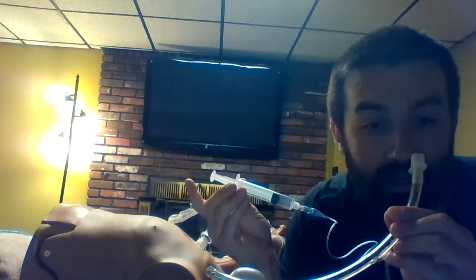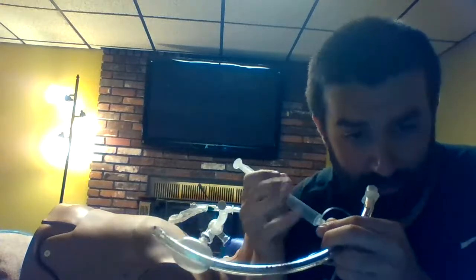So that tells me that when I'm applying volume or air into this pilot balloon or this pilot line in that cuff, if that happens, and be careful, you don't want to pop it, that means that the system is sealed while that syringe is on there. So in those cases, if I do this, my cuff inflates and my leak goes away, maybe I fixed the problem. But this tells me that I probably do not have a rupture in my cuff. And if I do, it's a very, very small one. The most likely cause is that there's not a rupture on that thing. Then I would properly inflate that, usually minimal occlusion volume or cufflator or anything.